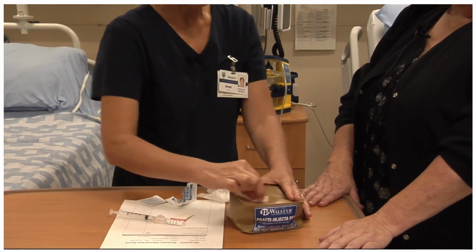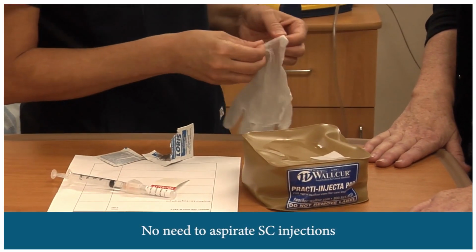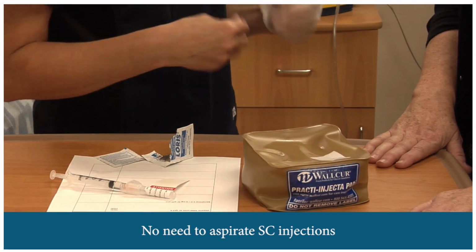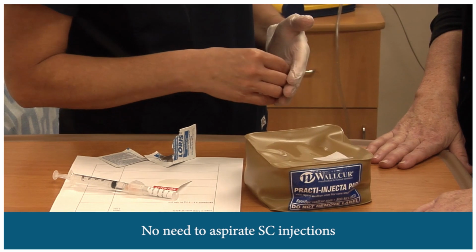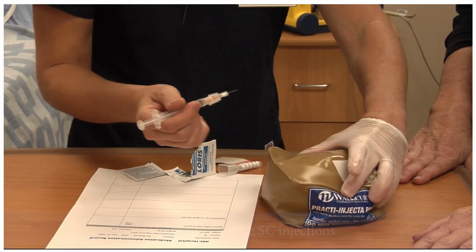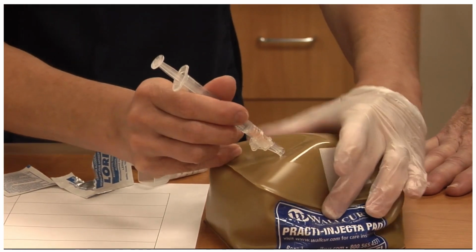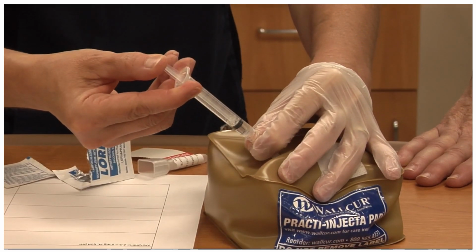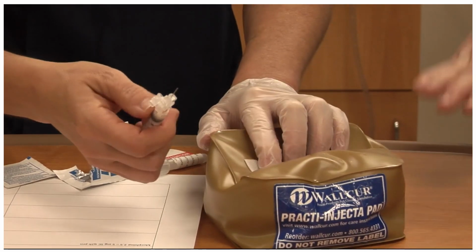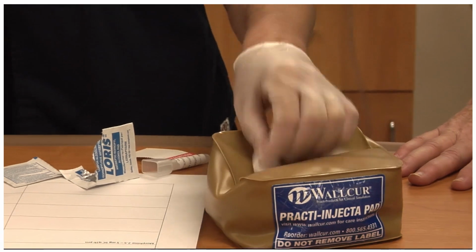So I'm going to find my site, clean it. Now, the difference between your subcutaneous injection and your intramuscular is your chances of hitting a blood vessel are very low, so you don't aspirate on subcutaneous injections. Okay. So I'm going to hold my pinch. I'm going to go at a 45-degree angle, a little poke, grab it, inject, and pull out. So we don't have to Z-track or anything with these? Nope. No aspirations? No, exactly.